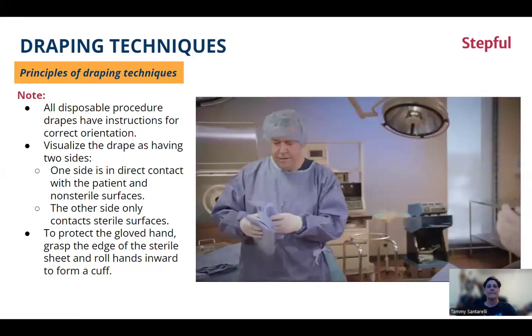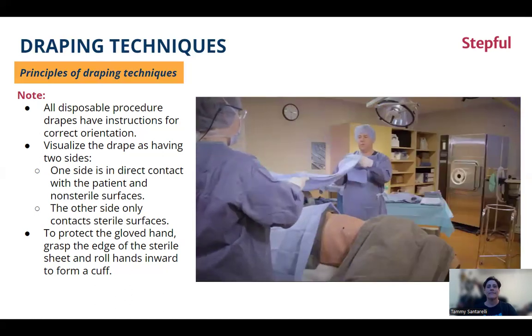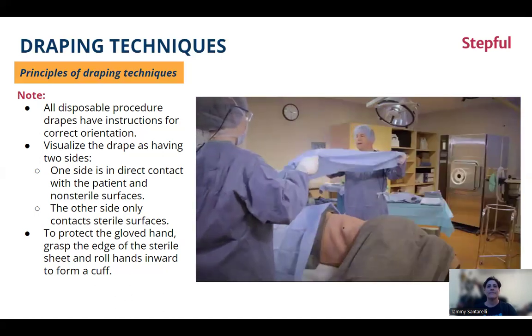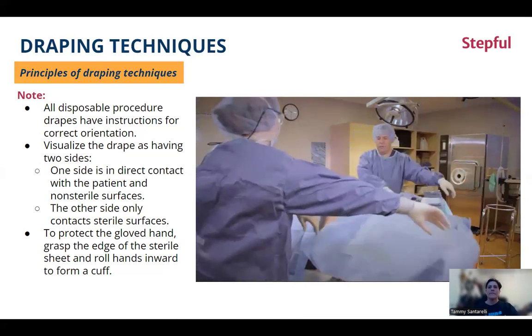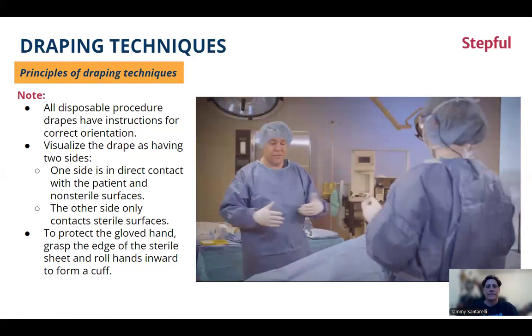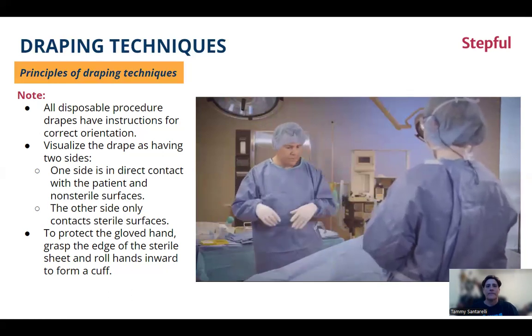Next medium sheet, I'm going to give to my surgeon. We're going to unfold it, extend it, make a cuff. See, they're cuffing their hands superiorly. Now, I like to do this first because it covers most of the patient and helps cut down on contamination.